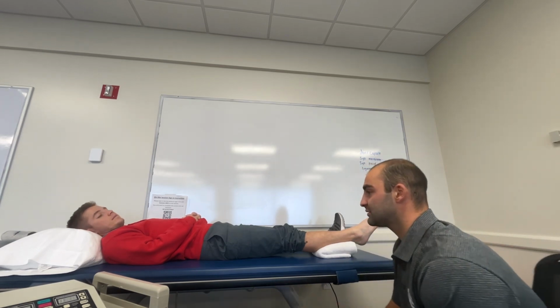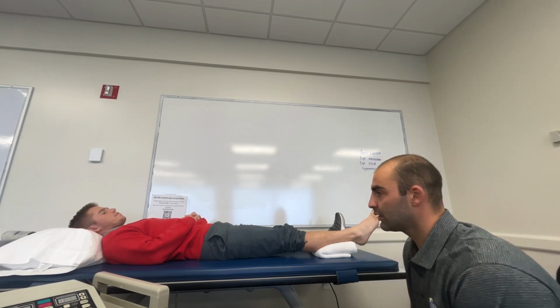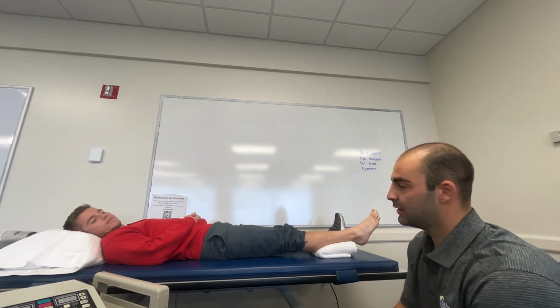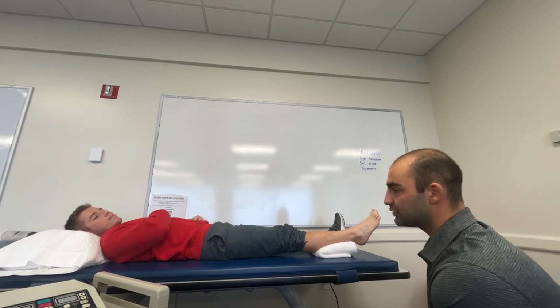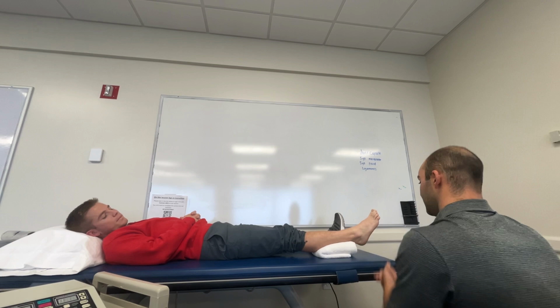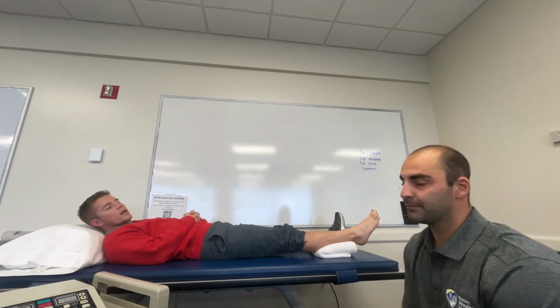Contraindications for this modality include active cancer, implanted electrical devices, seizures, disorders such as cardiac abnormalities, and areas of impaired sensation. So with that said, do we have any known active cancers? No, sir. Do you have an implanted medical device? No, sir. Okay. I know from our patient history that we did have some cardiac abnormalities a few years ago, but that is a regional contraindication for this modality. So because we're working on that lower extremity down here, it's not something we have to worry about because we're not in the area of that heart. Okay? Okay, thank you. Awesome.